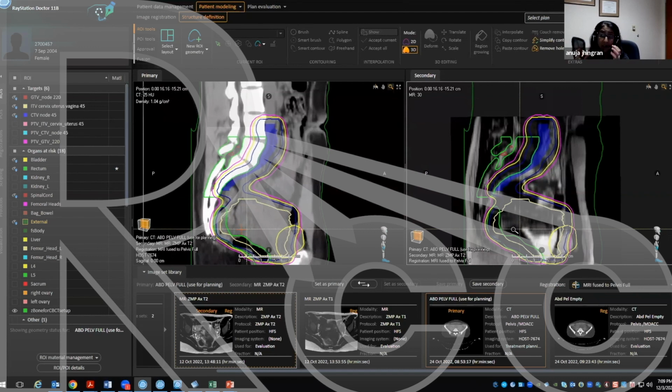We did daily cone beams because you had to be a little bit careful about this, and it never changed. So it stayed retroverted. It didn't change with bladder filling, and it didn't change with the tumor shrinking. In fact, when we did her first brachytherapy, with the dose that I showed you, it stayed retroverted. So I'm going to ask you guys a question, and I think this is very relevant.